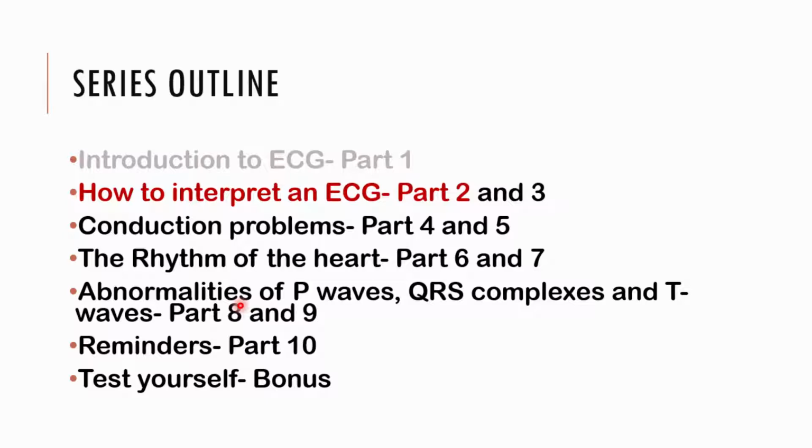The interpretation of the ECG, we shall cover it in two parts. In this lecture, I will give you the basic components of an ECG and what they represent, the normal findings on the ECG, and I'll mention a little bit about some pathologies. Then in part 3, that's where the serious stuff will begin. I'll give you a step-by-step sequence of how exactly you should be interpreting an ECG from now on until the day you die. Maybe not the day you die, but until the day you retire as a medical practitioner.